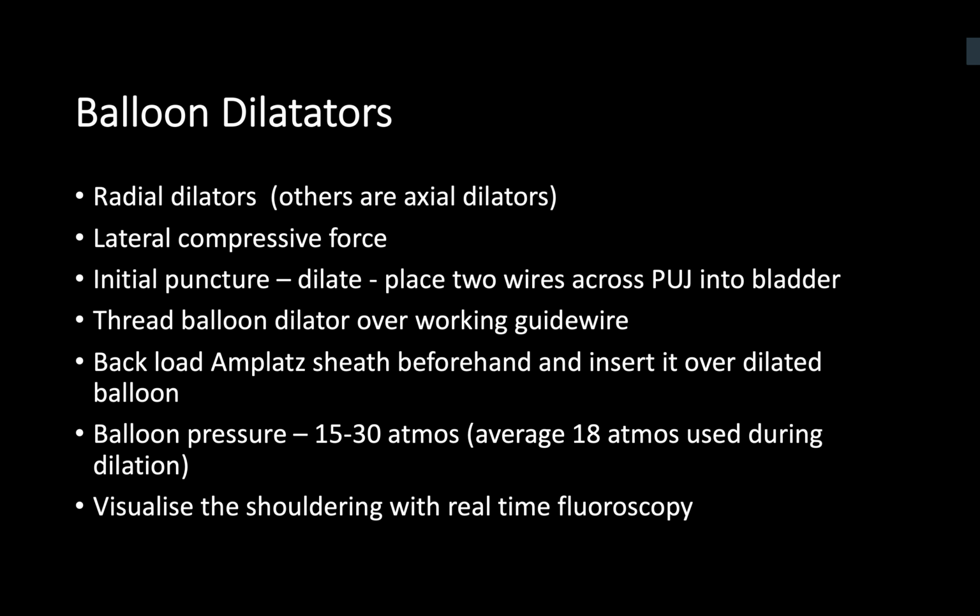Do you know the advantage of balloon dilators compared to the other dilators? So these result in less incidence of trauma to the kidney. The dilation can be controlled in terms of doing it to a maximum pressure, not going beyond that.